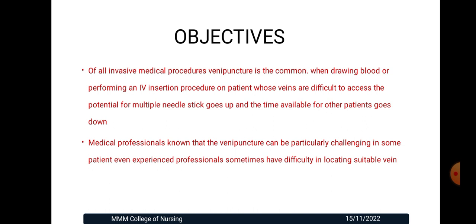Coming to the objectives. Of all invasive medical procedures, vein puncture is the most common. When drawing blood or performing an IV insertion procedure on a patient whose veins are difficult to access, the potential for multiple needle sticks goes up and the time available for other patients goes down.